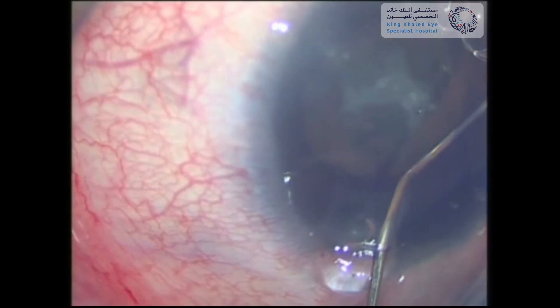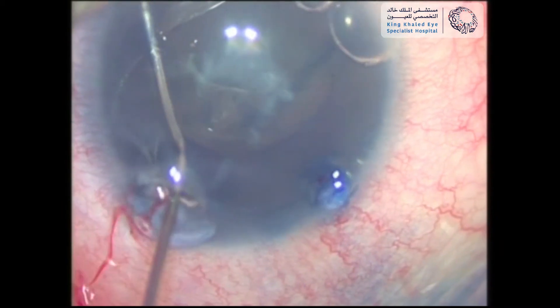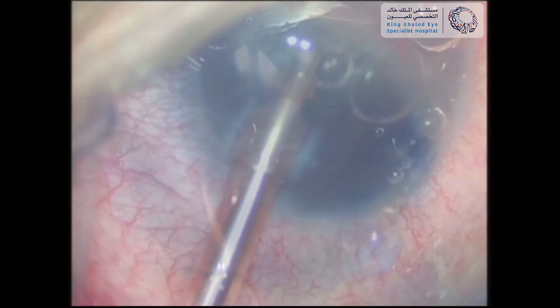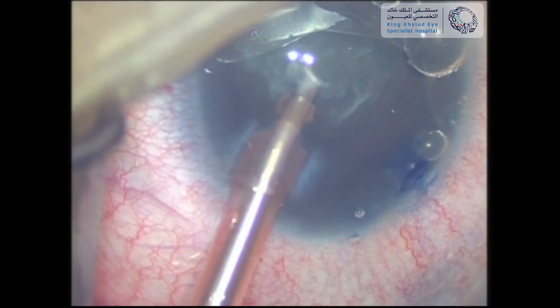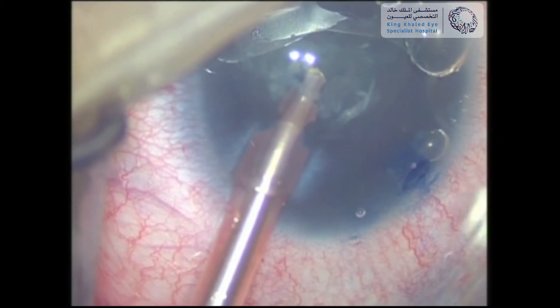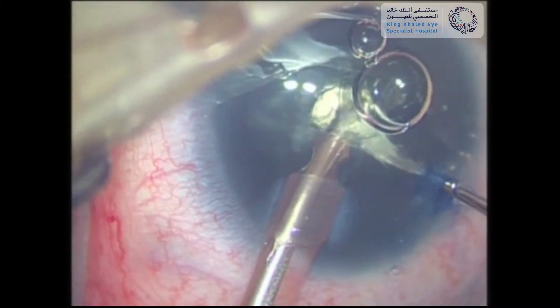This was followed by gentle hydrodissection to loosen the attachments between the lens and its capsule, and the same thing was also repeated on the other side. Then we proceeded with lens aspiration using the phaco probe. The lens was soft, therefore no ultrasound power was needed. A spatula was used for manipulation and to aid the phaco probe in aspiration.